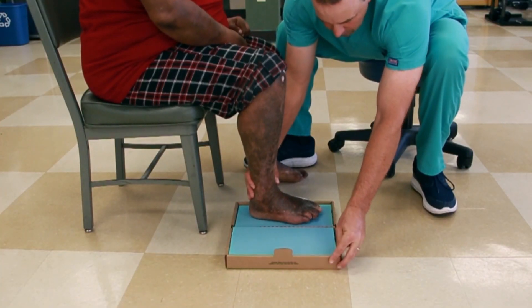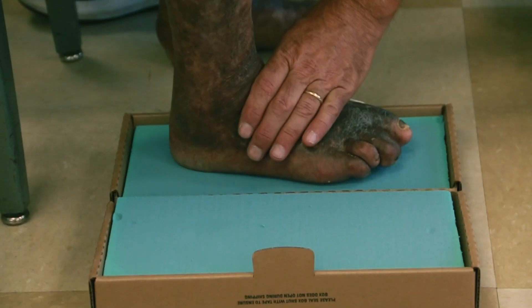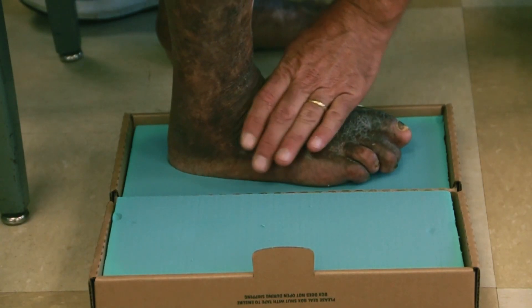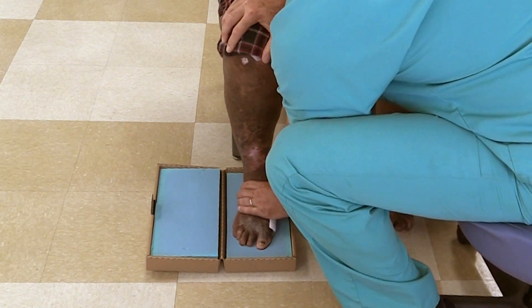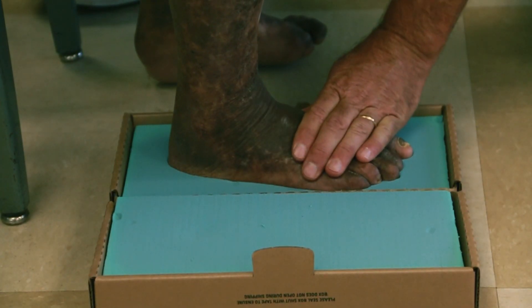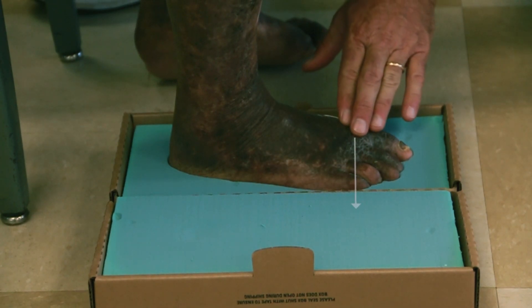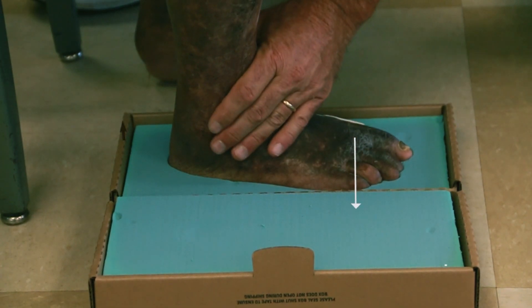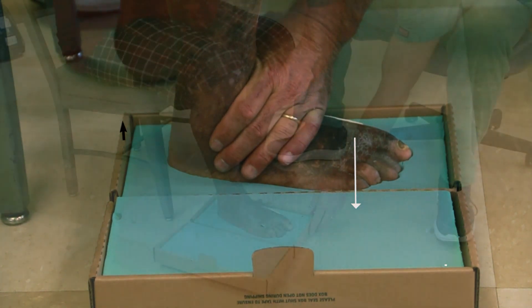Make sure the foot is centered and, using one hand on top of the knee and the other hand on top of the foot, apply firm pressure and allow the foot to sink into the foam. Firmly push down on the top of the first ray and the front of the ankle to ensure a good impression of the first metatarsal head and the heel.